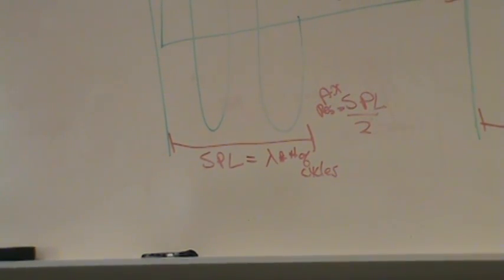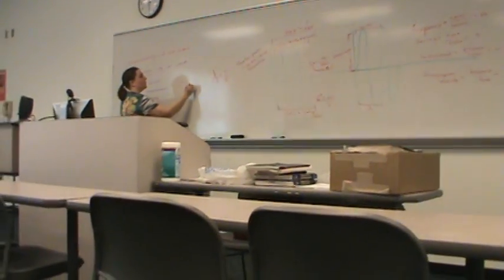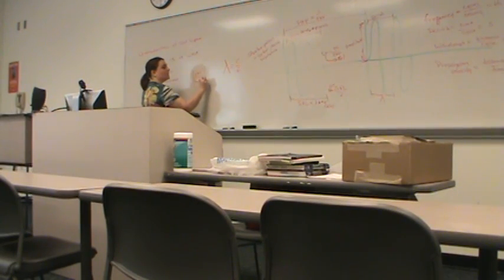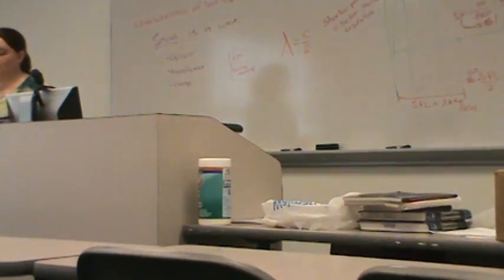The one thing we didn't talk about with transducer design was all of the different components of it. We had the PZT component, and then we had this backing material or damping material. I'm bringing that up now because it relates to this short pulse stuff. So that backing material or damping material, the whole idea was that it's to shorten the pulse to make our resolution better.